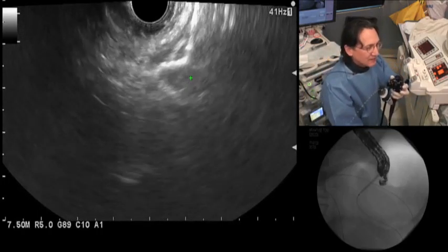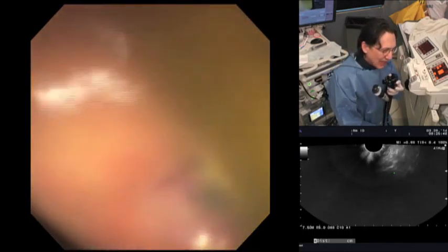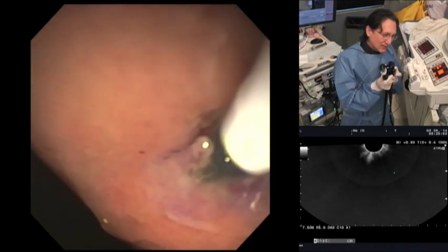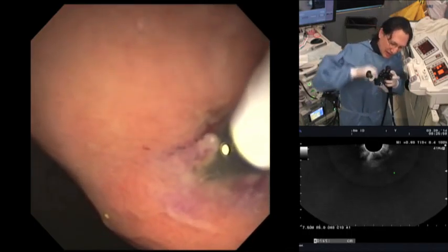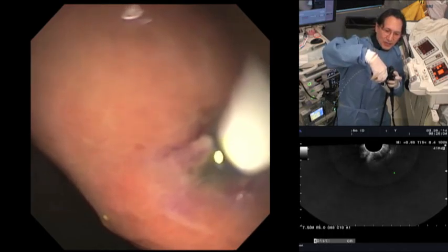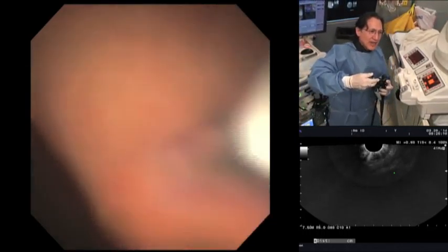So let's have the endoscopic view, and I'm going to pull back until I see the white catheter sheath, and wait till I see the black mark. And in a moment, you will see that black mark. You can see it right there? Once you see that black mark, you are ready to deploy the proximal flange. So I'm going back here. I'm going to unlock this again. And I'm going to pull this back. And so you're going to look on endoscopy now.